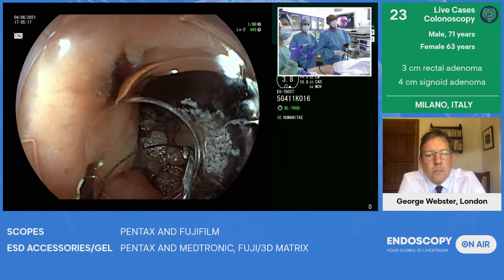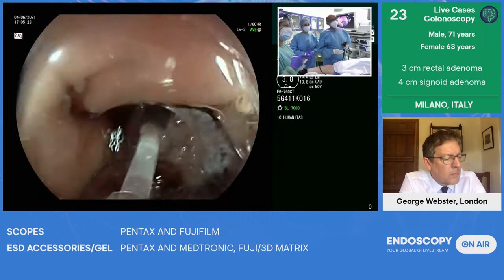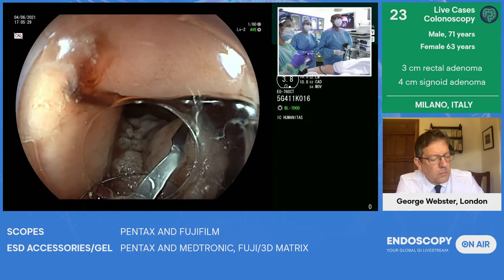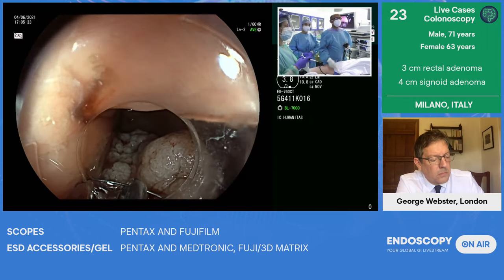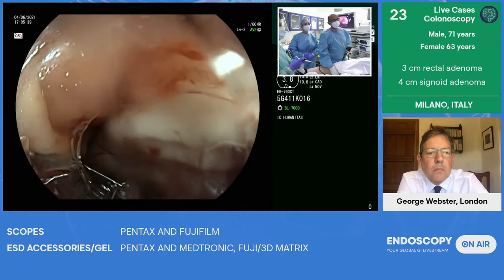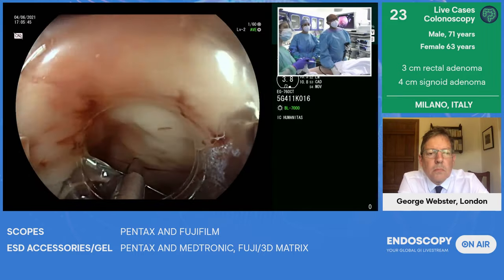Open, please. So this is the second clip, if you rotate it like that. Yeah, thank you. Okay, just close gently, close, yeah, okay. So look, I got the traction wire, George. Now the challenge is finding the right place to deploy this so that we get enough traction but not too much, and also in the right direction.